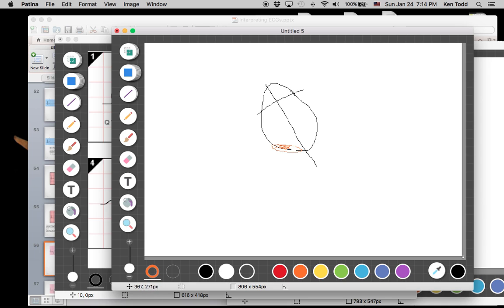So I had a big infarct on my inferior wall. Actually, you know what? We'll change that. We'll make it an anterior or lateral wall MI. And let's say we're going to look at this through lead 1. So our lead 1 is negative here and positive over here.